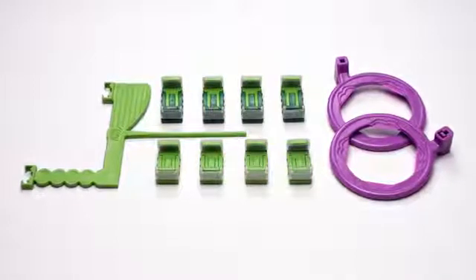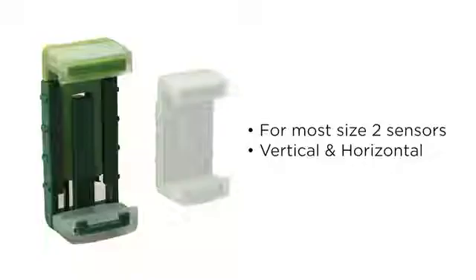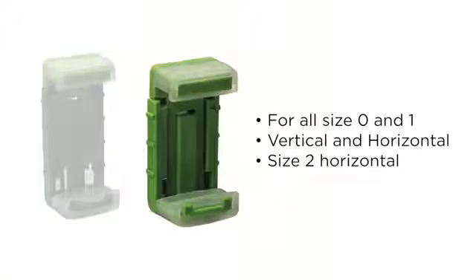Begin by selecting a holder that works best for your sensor size. The dark and light green holder is for most size 2 sensors in the vertical position and all in the horizontal. The solid green is for smaller sizes, generally all size 0 and 1 sensors in both vertical and horizontal positions, and size 2 sensors in the horizontal position.